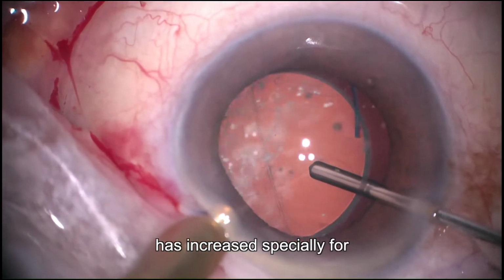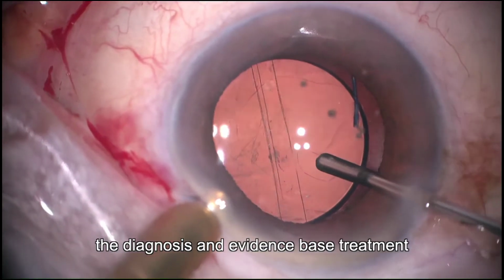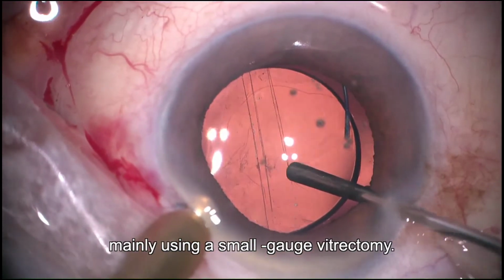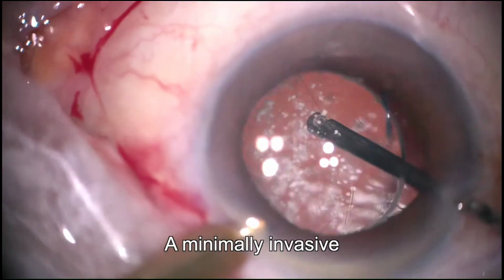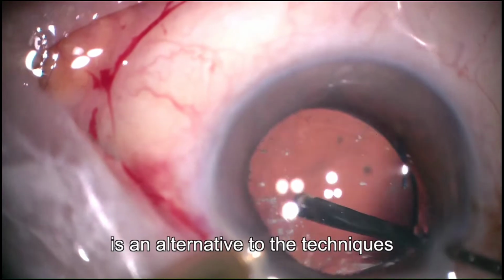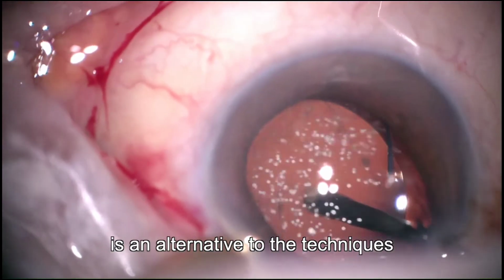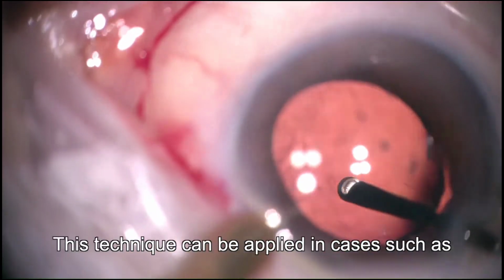The number of people with visual disability caused by floaters, or symptomatic vitreous opacity, has increased, especially with regard to diagnosis and evidence-based treatment, mainly using small gauge vitrectomy. A minimally invasive transcapsular anterior vitrectomy technique is an alternative to the technique described in the evidence-based treatment.